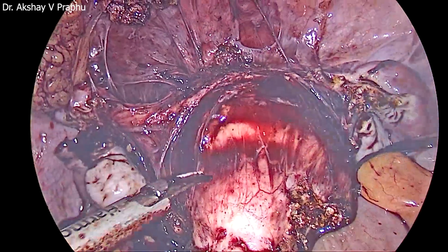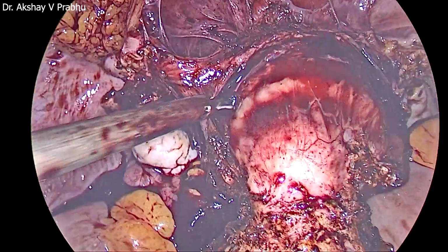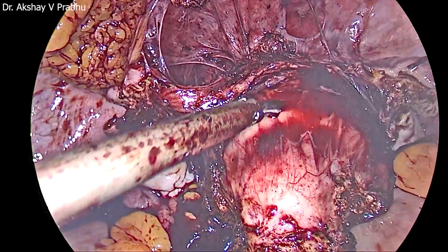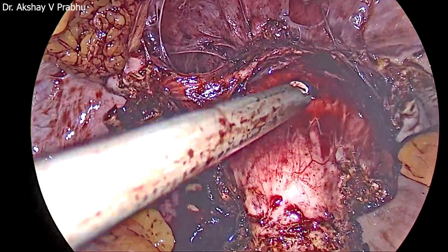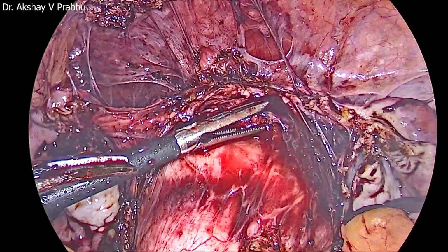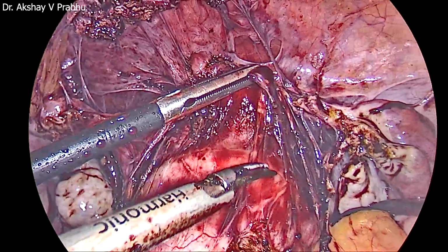Because if there are any micro leaks or any doubt like that, there will be seepage of the methylene blue diluted saline into the peritoneal cavity. So watch for some time, let the bladder fill up completely, be sure that there is nothing, and then you can come out. So in all cases where you feel there is some bladder injury or possibility of any bladder injury, a micro leak or something, do the methylene blue test, and if required you can keep the catheter for 24 to 48 hours for better healing.